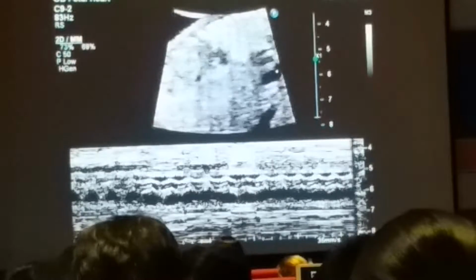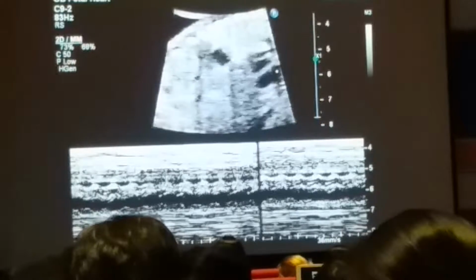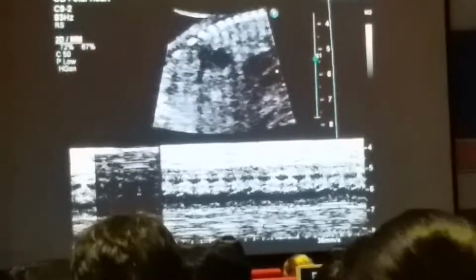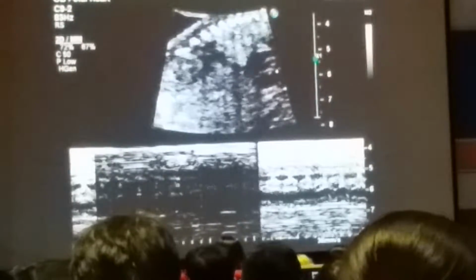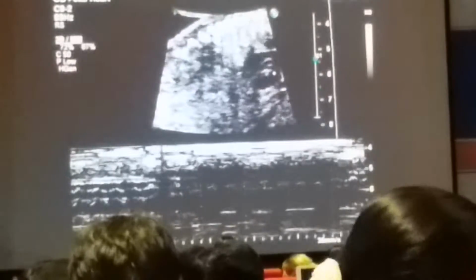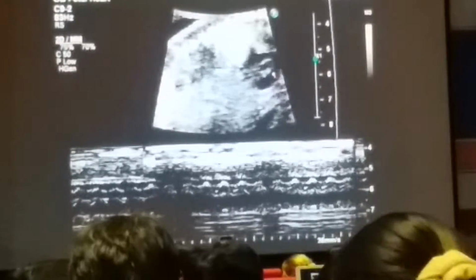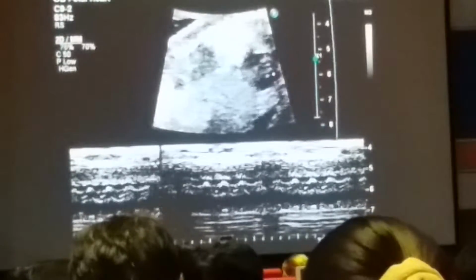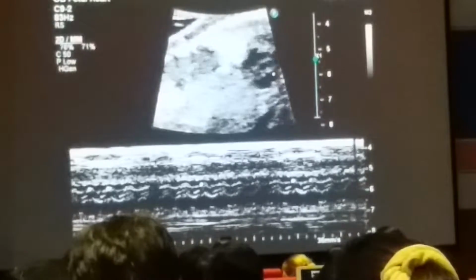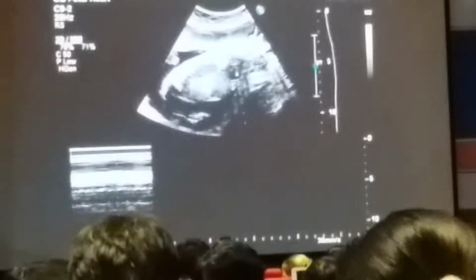And now how do I speed it up? Because you can't see anything at this speed. Can you make that image better? Is there something that we can go and use, the eye scan? Will that help? No. Okay, so the aorta is definitely behind the pulmonary artery. There it is. I should be getting a box signal. There's the aortic valve in there. Can we zoom in on that? Let's make it bigger. Yeah, on the M mode. Can we zoom in on the M mode?